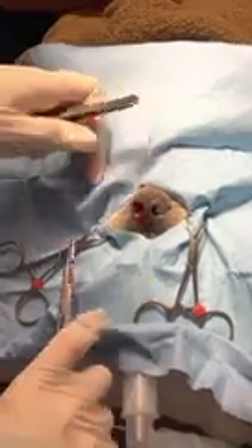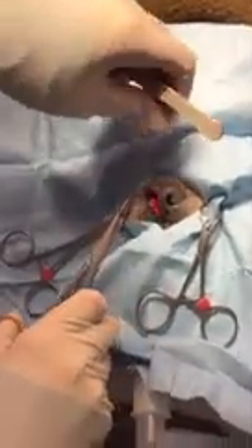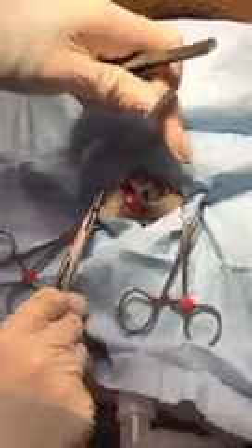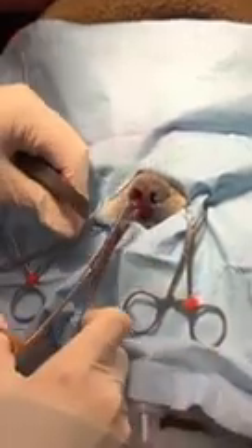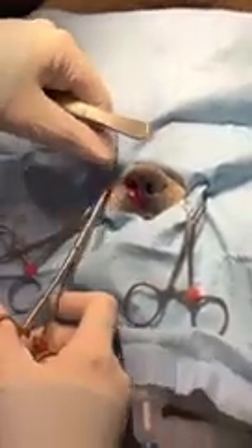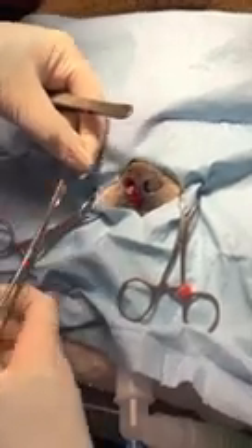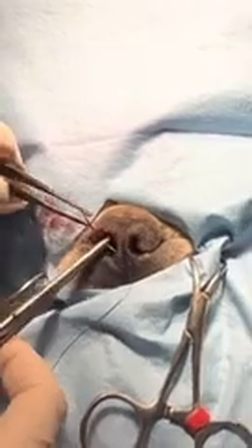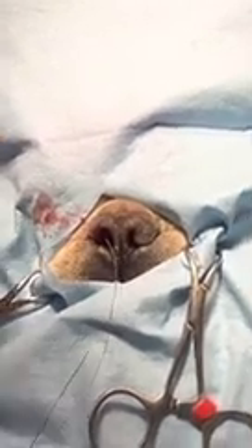That'll stop the bleeding right away. Kind of pull it out laterally to open that nose hole up, then cut the tails real short. You can see already the difference in the size of that nostril — this one I can barely get air through, and this one I've got a nice open airway. The dog's going to be able to breathe a whole lot easier.